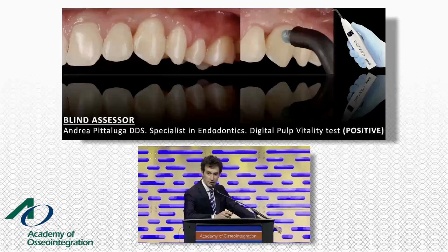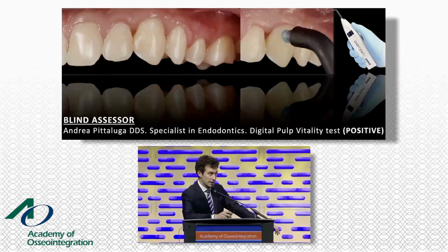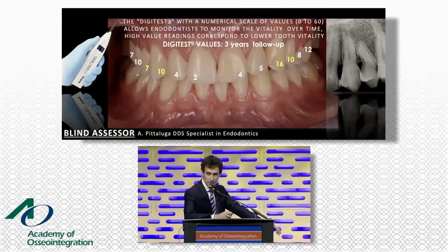But we decided to ask another blind assessor because we wanted to have concrete numbers. We asked him to check with a different kind of test, not the dichotomous one that gave us just yes or no, but with an electric test. Digitest is an electric test that gave us numbers, so we can have concrete relation of the vitality of our teeth, and you can see these are the results. The vitality is good. So as the endodontist shows, even if you don't see the canal, the tooth is vital.